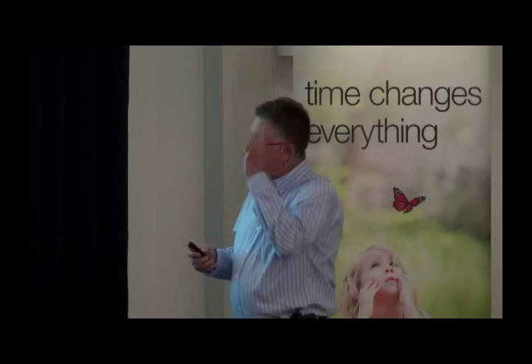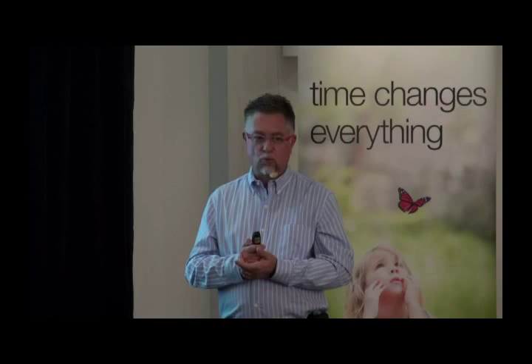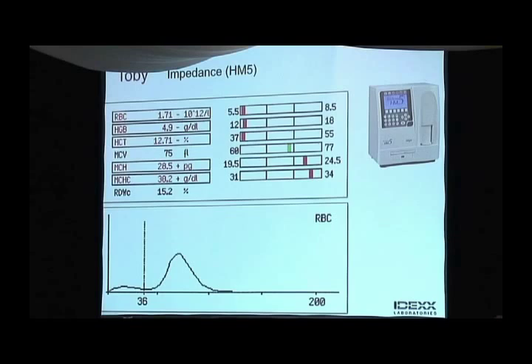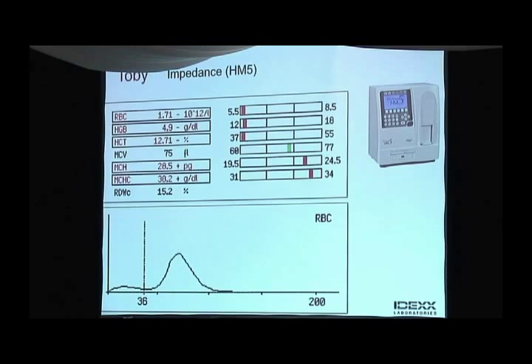And how many of you guys remember what the RDW is? Red cell distribution width, all right? And remember, what does the RDW mean? Notice that in Toby it is normal. I'm going to tell you what the RDW actually means. So if you look at that histogram, I'll go back here. Those are the platelets, all right? This actually, in the horizontal axis, you have volume in femtoliters, all right? So those are the platelets, and those are the red cells, okay?